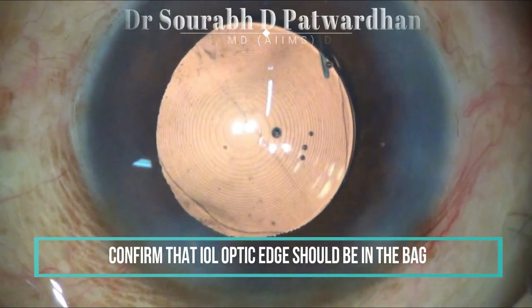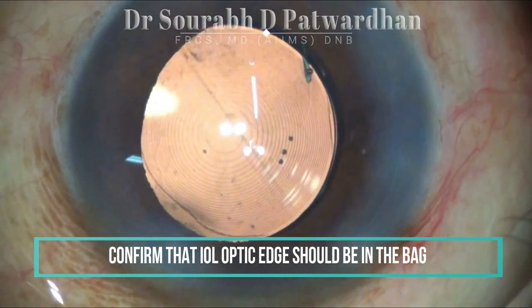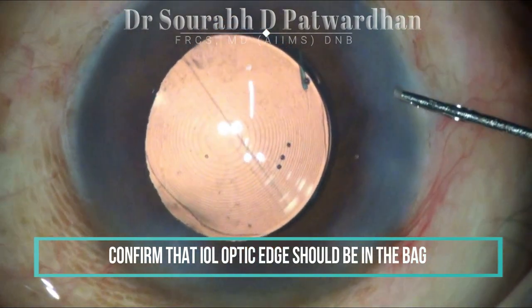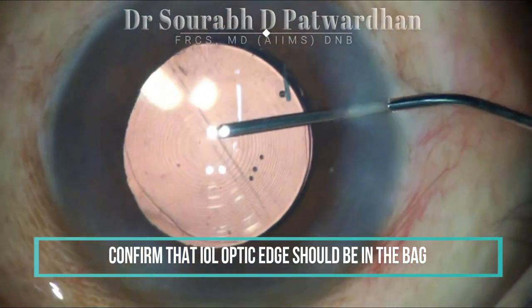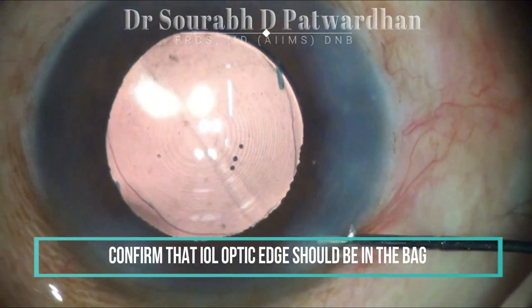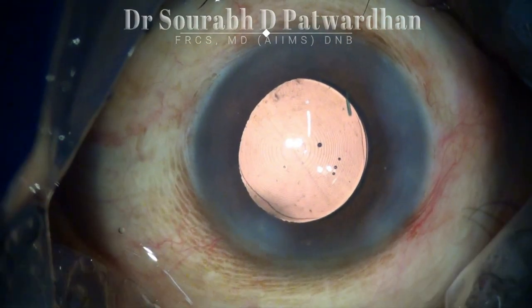Once you implant the IOL, make sure that the IOL optic is completely in the bag. Before you close the surgery, confirm that the optic is not coming out of the bag. This is important for refractive stability later.